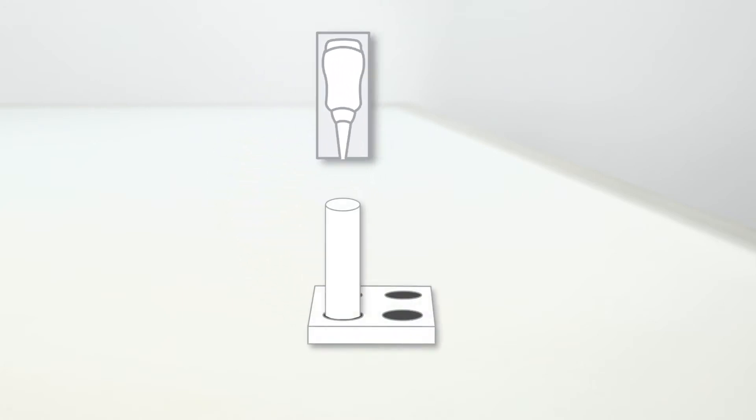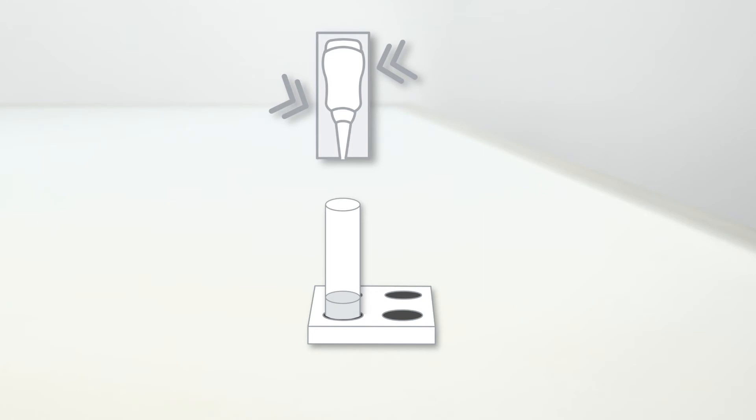Place a clean extraction tube in the reagent holder. Open the buffer ampoule by twisting off the tip. Make sure to hold the buffer ampoule vertically, squeeze it and add the entire buffer solution to the extraction tube.